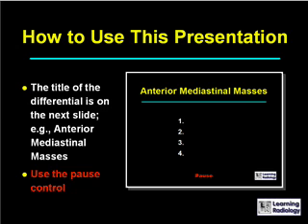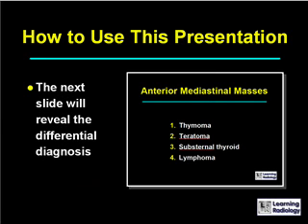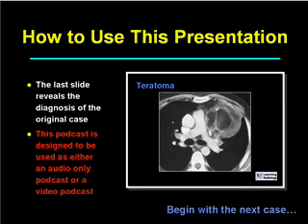The next slide will be the title of the differential and the number of causes. Again, use the pause control. The next slide will reveal the differential diagnosis itself, and the last slide will reveal the diagnosis of the original case. This podcast is designed to be used as either an audio-only or a video-only podcast or both.